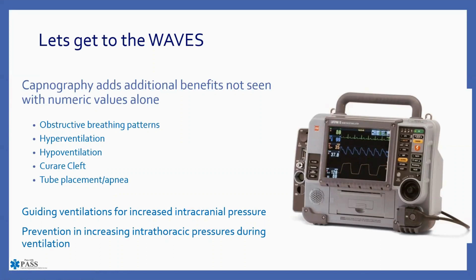From my personal perspective, and as a previous EMS administrator, what I would personally recommend to you all is anytime you have a tube through the glottic opening, you need to have capnography on it. It is a class 1 recommendation from the American Heart Association, which means that if anything goes sideways and they look at that report and you did not at least attempt to have waveform capnography, you're going to have a lot of questions that need to be answered.